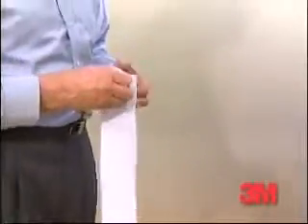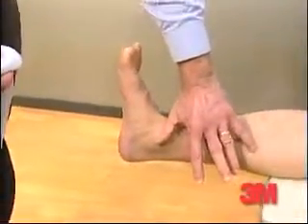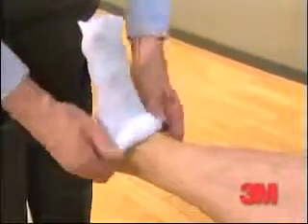shoe over the wrap. So the way this one is applied is over one layer of stockinette with some selected areas that will be padded just for abrasion purposes. So the stockinette will be applied over the foot and ankle, and the ultimate cast will extend just about 6 or 8 inches above the malleolar area. Again, we've rolled the stockinette for ease of application.